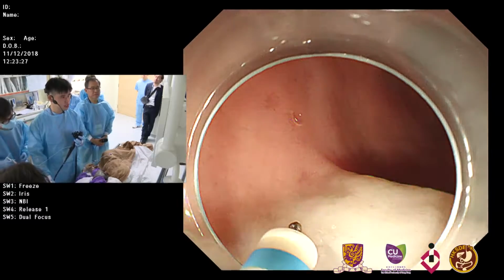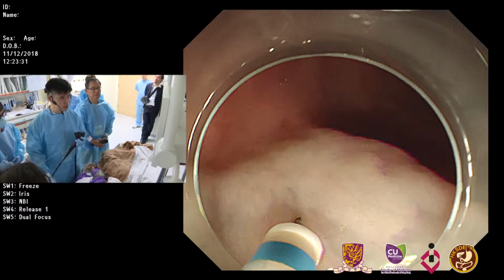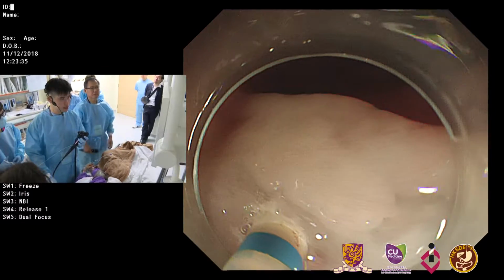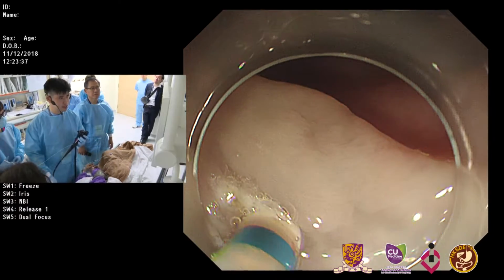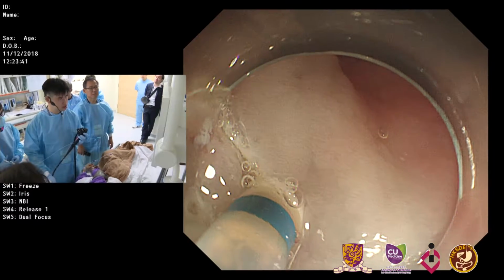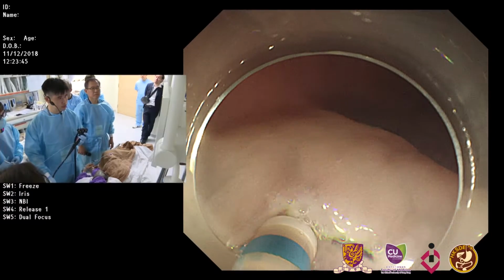The cutting current has less coagulating effect, so it's important that we should not cut too deep. Otherwise, it will end up with bleeding if there are vessels in the deeper submucosal layer. So just a superficial cut is enough.